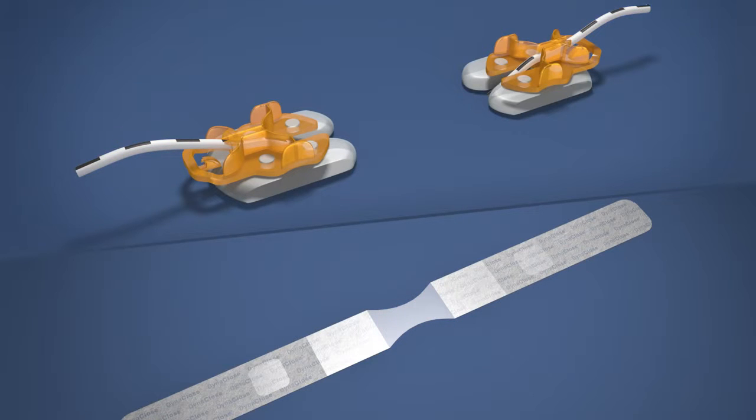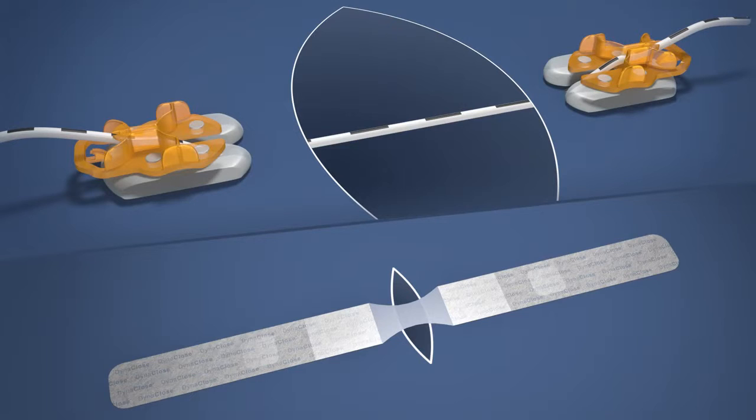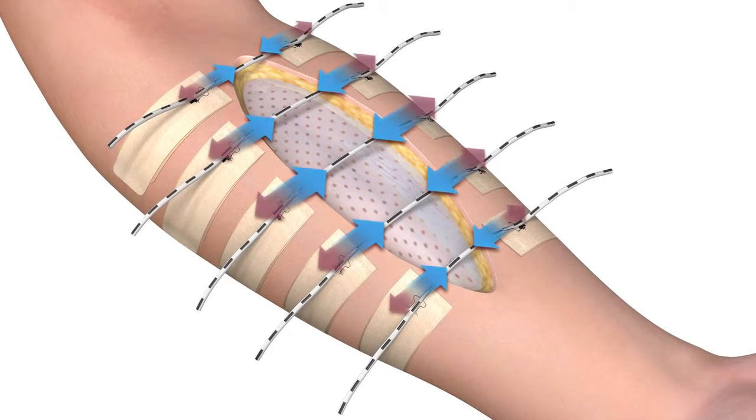With anchors on either side, the elastomer spans the open wound. The closure system used is determined by the type and size of the wound. When applied, these devices exert appositional forces, which counter the lateral retracting forces of a wound.